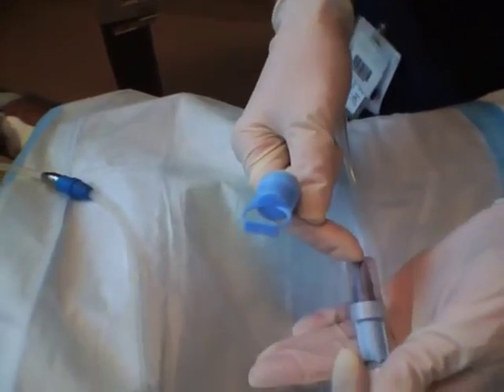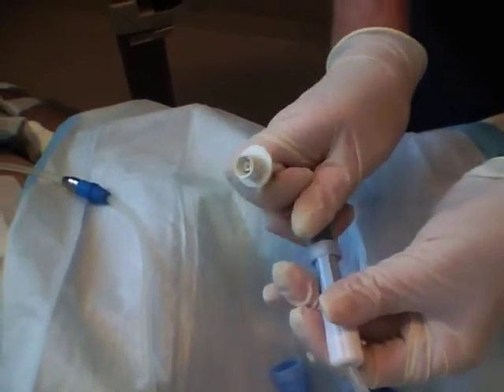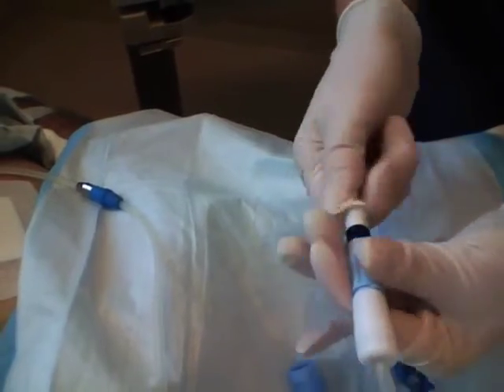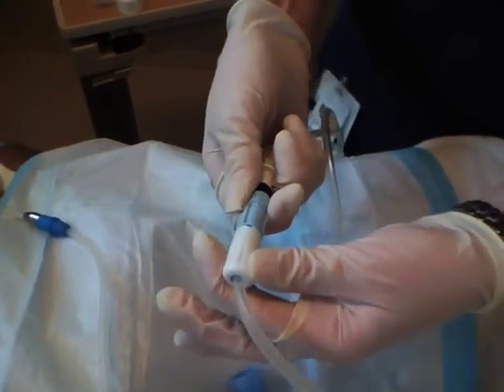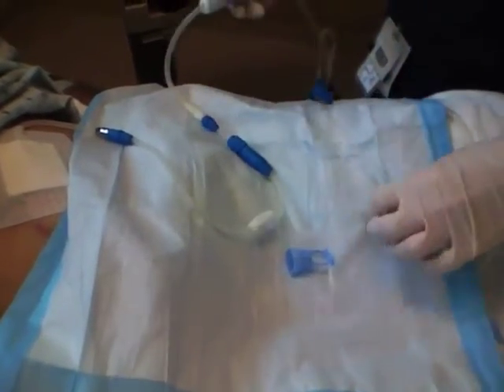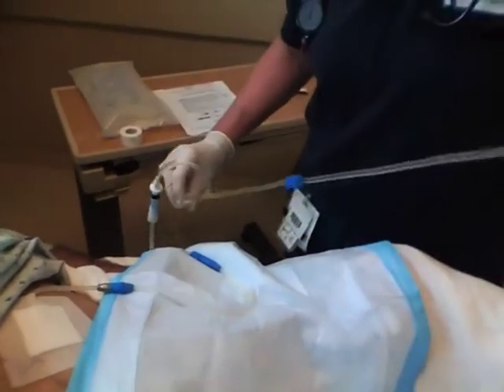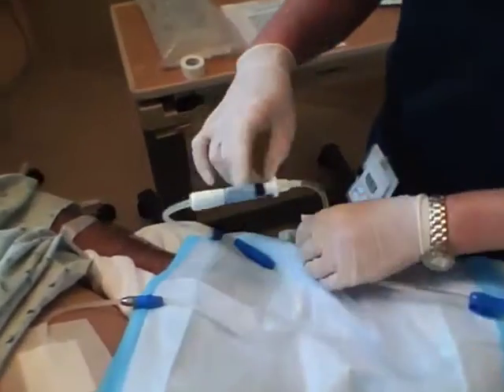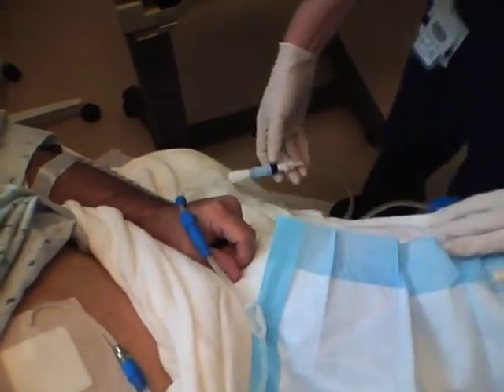I'm going to expose my female connection first, and then expose my male connection, and thoroughly put those together. Now, this here has a clamp on it as well. I'm going to open this clamp, and I'm going to open this clamp, and by gravity — I'm going to open this one as well. You can see that the one that spikes our dianeal bag, I'm not opening that clamp. I'm just opening this clamp, which is going to see if he has any peritoneal fluid to drain out.